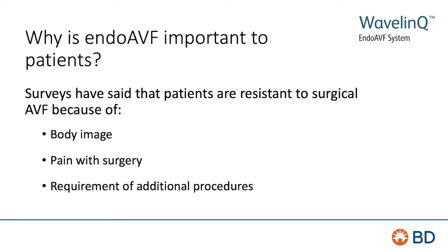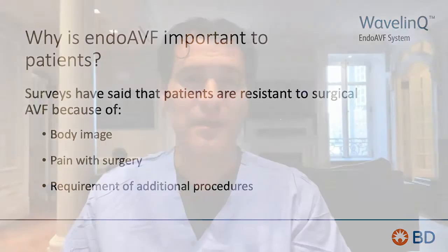I would just say that anecdotally, that first bullet point there, when I was first doing this procedure, I underappreciated how important the body image was. Patients are really dissatisfied with those large runaway fistulas with these ropey snake-like veins. And I'm amazed at the number of patients that are coming in requesting to not have that. They know they need dialysis. They're referred to me. They're seeing a vascular surgeon. All they know is they don't want that. They've seen that. They've Googled images. They may know somebody who's on dialysis and sees their fistula.